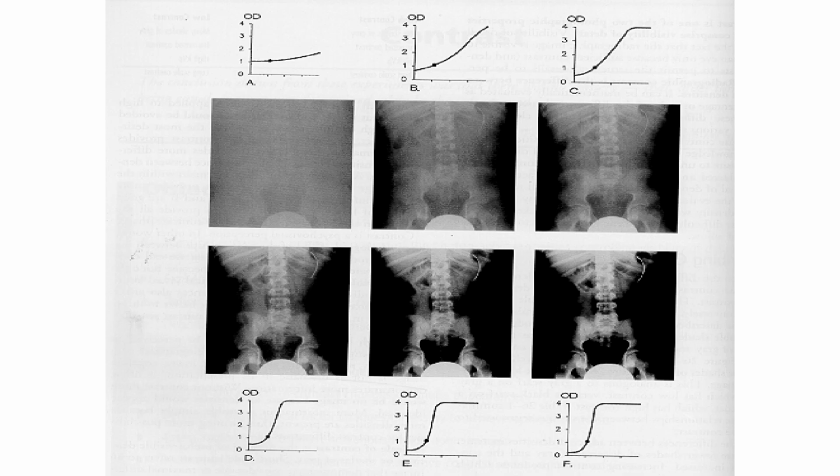Bakit? Bukod sa nakikita yung bones, yung mga soft tissues ay nakikita rin. So nakikita natin yung large intestine, stomach, yun. Saka yung bladder. Okay?